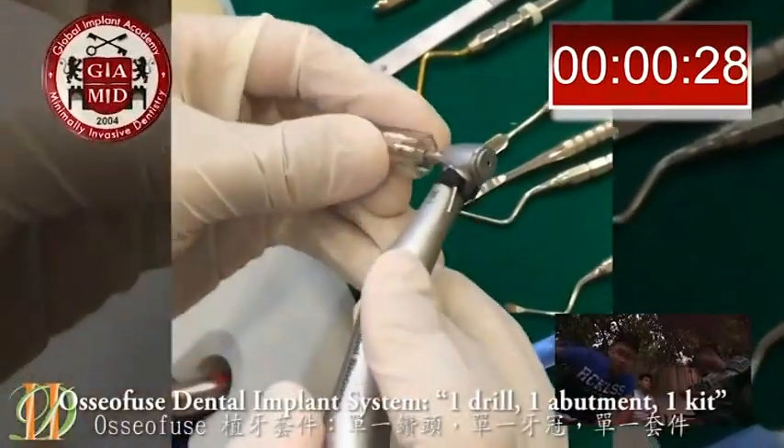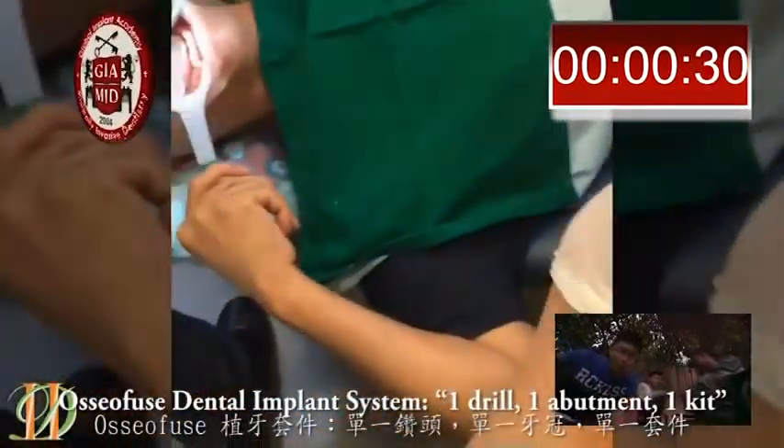Osseofuse Dental Implant System: one drill, one abutment, and one kit.